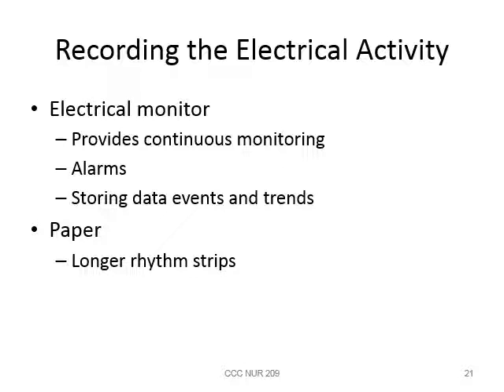So many times you're going to see basically a paper printed out to take a look at that strip. Before the EHRs came on board, most of the time these monitor strips had to be printed out and actually taped to a sheet of paper and placed in the chart as part of the records. Some of the EHRs are actually capturing the data and keeping that as part of the medical record.